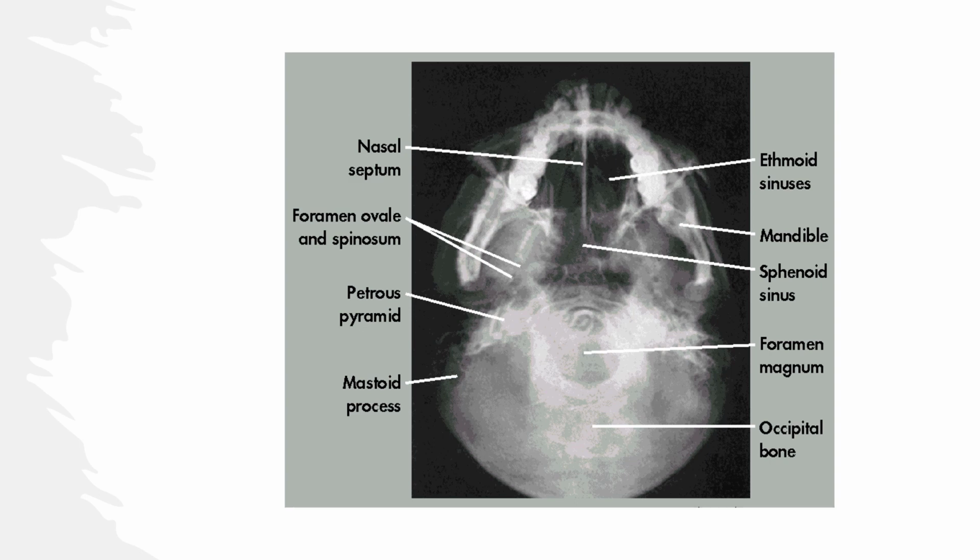You want to put your central ray on the intersection of the midsagittal plane and the line that passes between the patient's gonions. That is the angle of their jaw. So submento means you tip their head back, you find the angle of their jaw, and you draw a line between that, and that should form a crosshair with the patient's midsagittal plane.